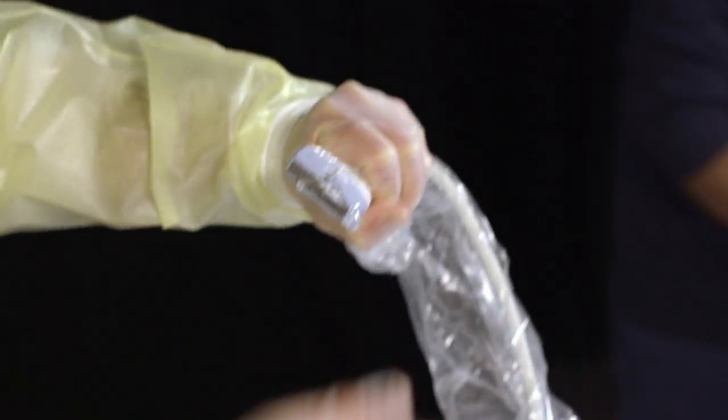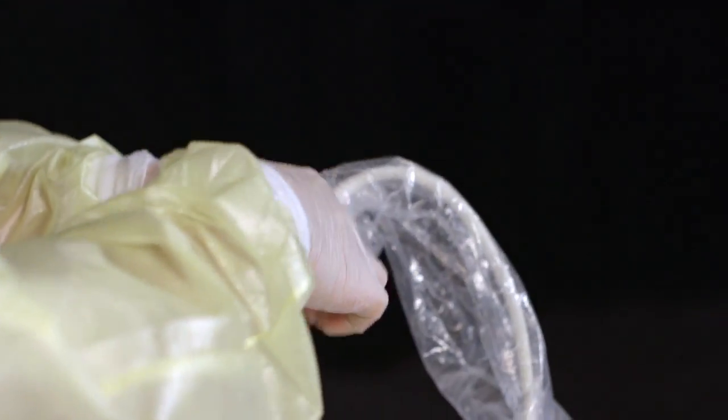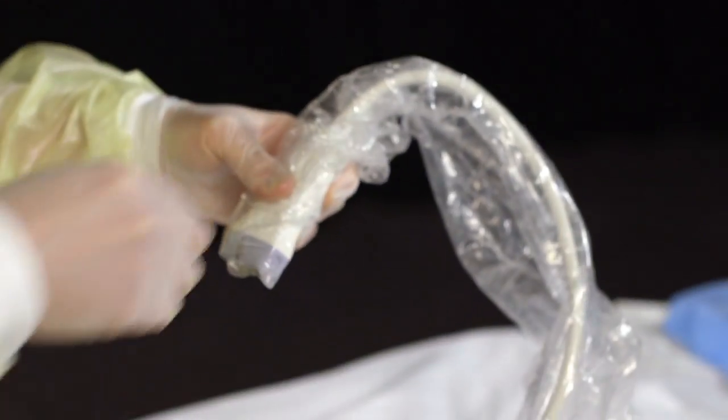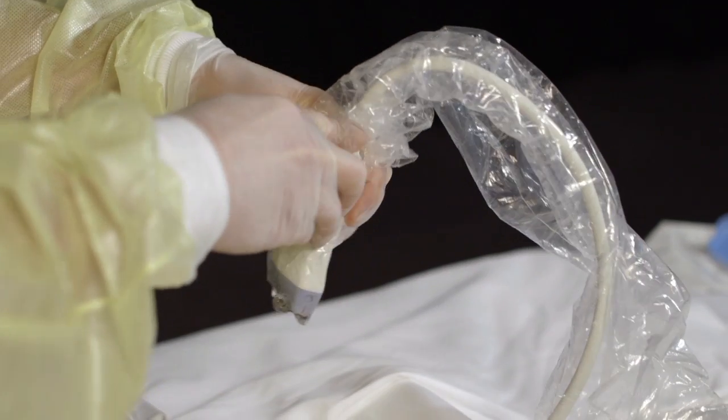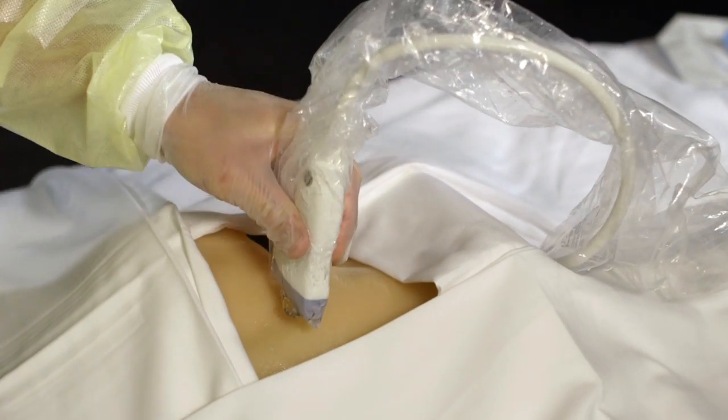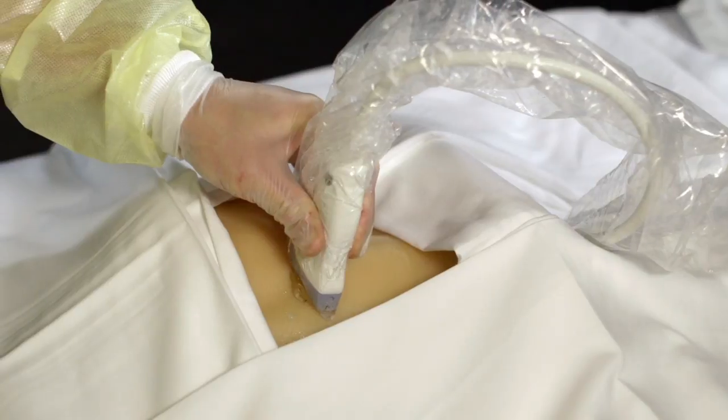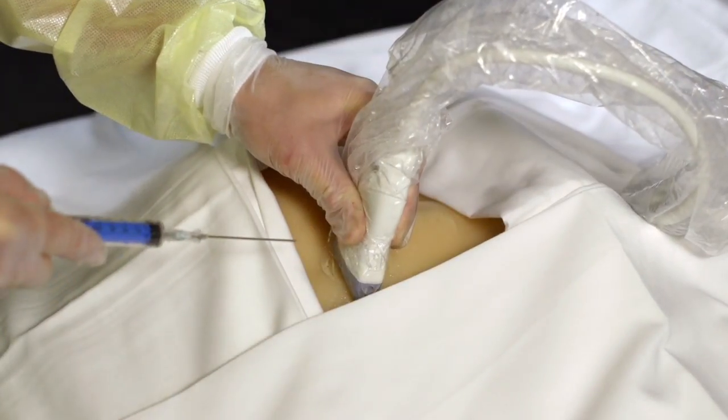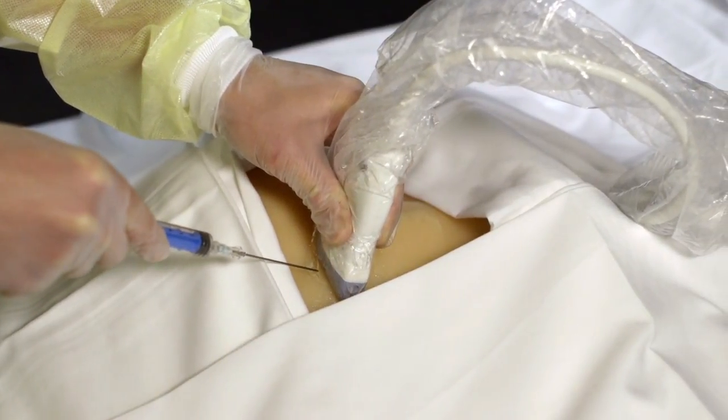Pick up the probe in your non-dominant hand and use a two-finger grip to lightly hold the probe in transverse orientation. Center the vein on the screen and note its depth. Look at the skin as you insert the needle through the skin. Then switch your gaze to the screen.